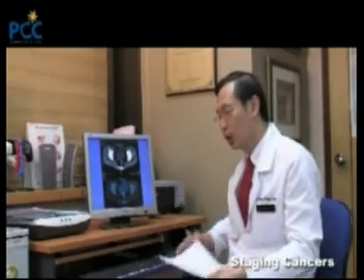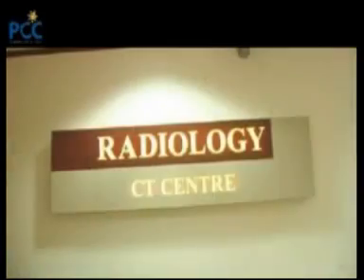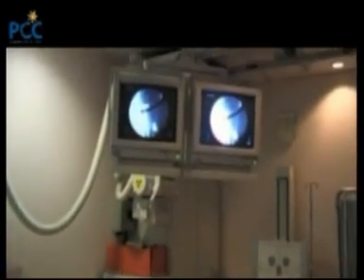How is this useful to us? This is useful to us in many ways. The PET scan has really revolutionized the way in which we stage cancers. In the past, we based the staging on X-rays, ultrasound, CT scan. But with a PET scan, we can actually stage a patient more accurately. We will be able to know, besides the main areas which we can see on an X-ray or on a CT scan, sometimes we can detect smaller areas which are not detectable on a CT scan.